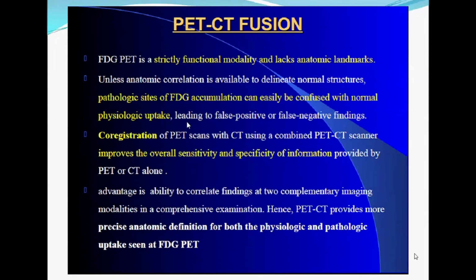Okay, that I have already discussed. Sometimes, initially, unless anatomical correlation is available to denote normal structure, a pathological site of FDG accumulation can easily be missed. That was the lacuna with PET. So that lacuna was overcome by PET-CT fusion.